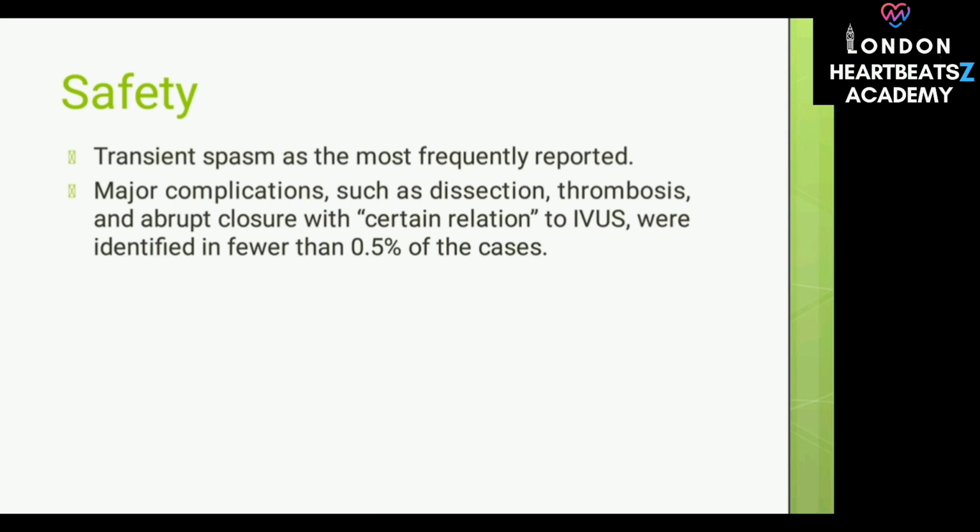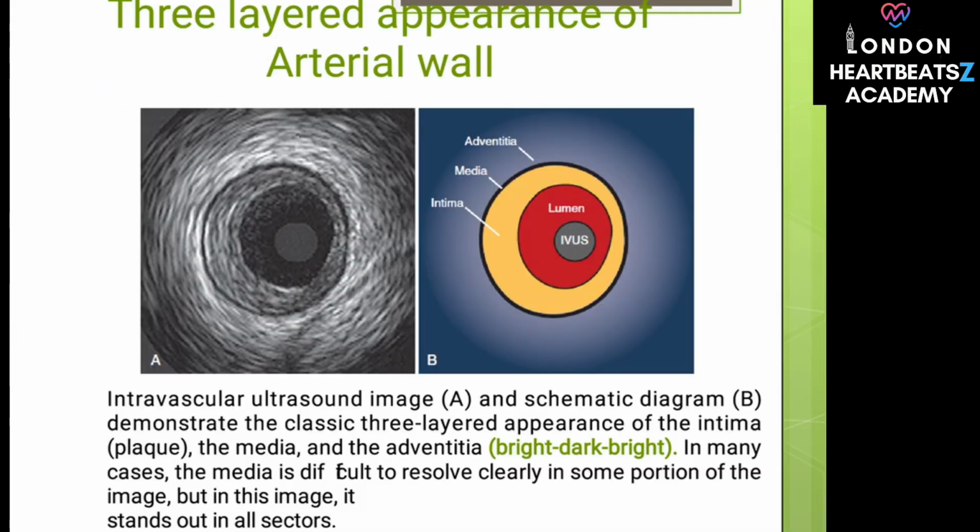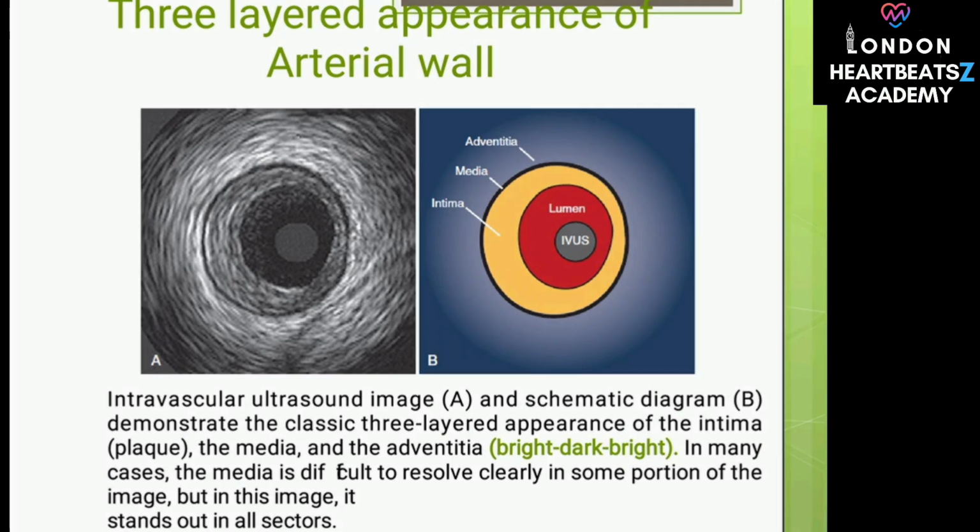Okay, so we've got the catheter in place and we're getting these cross-sectional images of the artery. What does a healthy artery wall, or even one with some atherosclerotic changes, typically look like when viewed with IVUS? The classic view. A normal artery wall, as well as an artery wall that has developed some degree of atherosclerosis, often presents with a classic three-layered appearance when viewed with IVUS. What are the three layers? These three layers correspond to the intima, which is the innermost layer and includes any plaque buildup, the media, which is the middle muscular layer of the artery wall, and the adventitia, which is the outermost connective tissue layer.